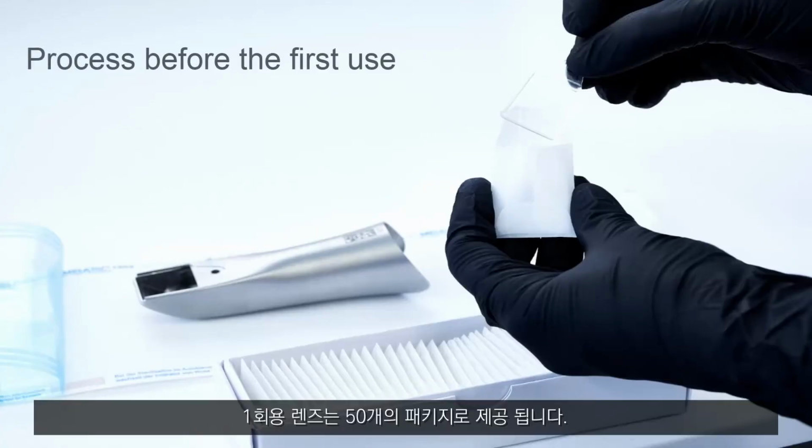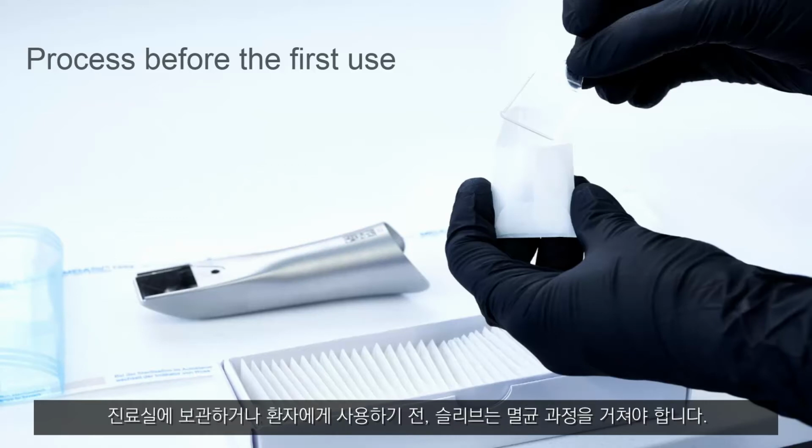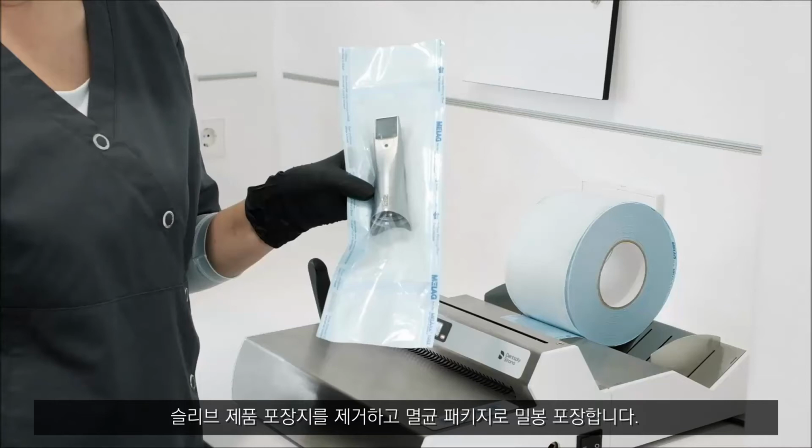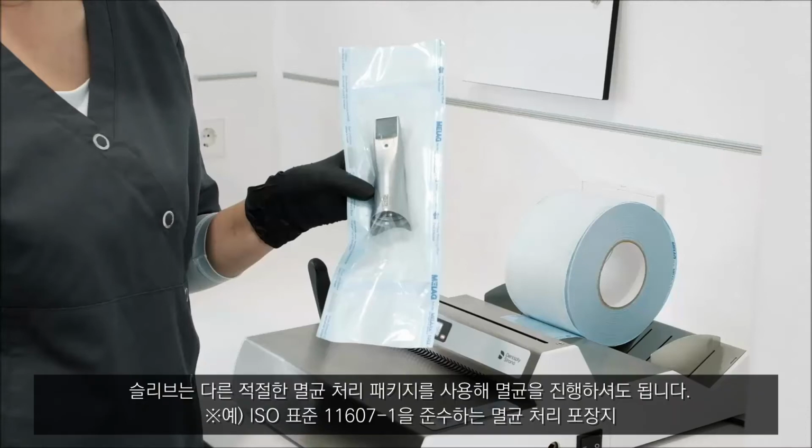The disposable windows come in packages of 50. The autoclavable sleeve is delivered clean but non-sterile. For storage in the practice as well as in preparation for the first use on a patient, the sleeve should undergo a sterilization process. We removed the sleeve from its original packaging and sealed it in sterile goods packaging. Alternatively, the sleeve can also be sterilized in other suitable sterilization packaging.